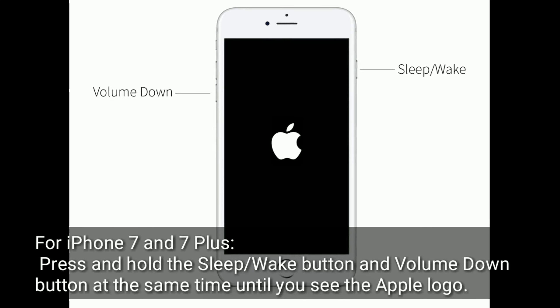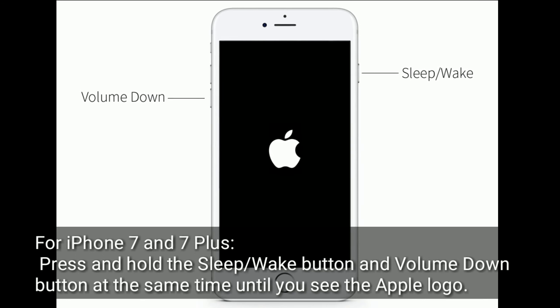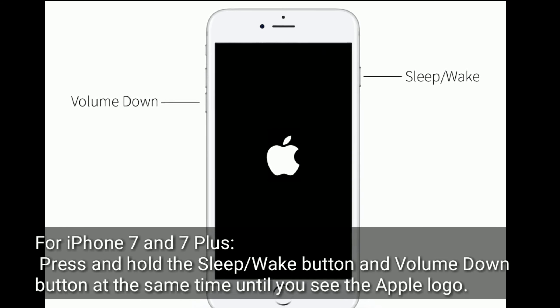For iPhone 7 and 7 Plus, press and hold the sleep or wake button and volume down button at the same time until you see the Apple logo.